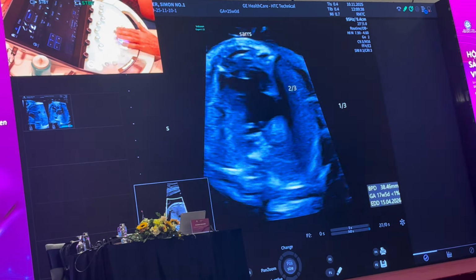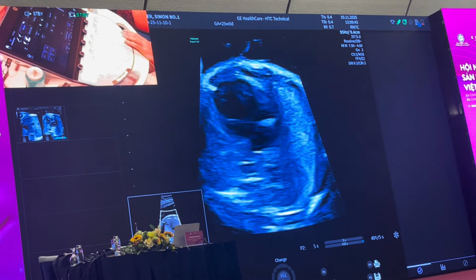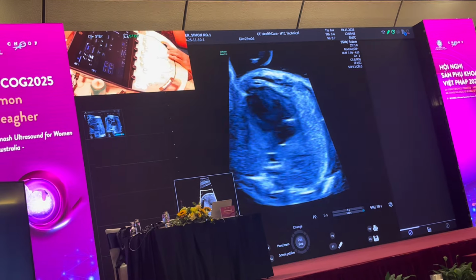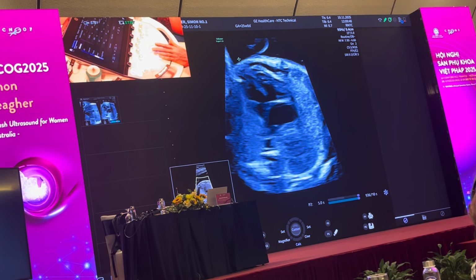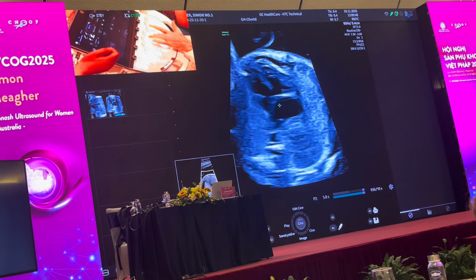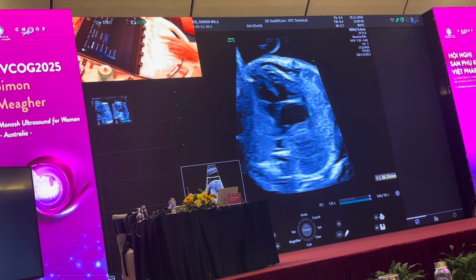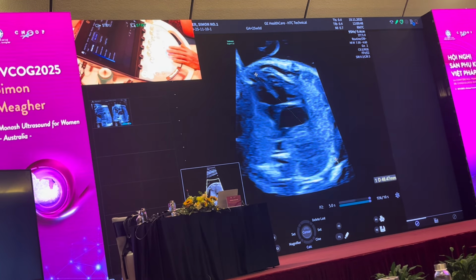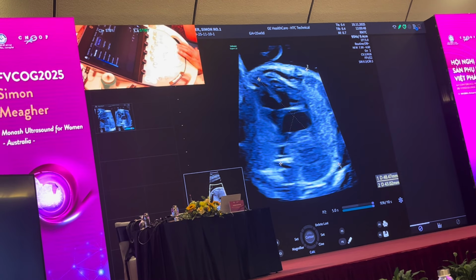When I look at the rate of the heart, just a moment, I'm not going to take a measure of it, but just eyeballing it, it looks like a normal heart rate. I look at the axis of the heart, I draw an imaginary line through the interventricular septum, and then I draw a line through the anterior chest wall, and I look at the axis of the heart.